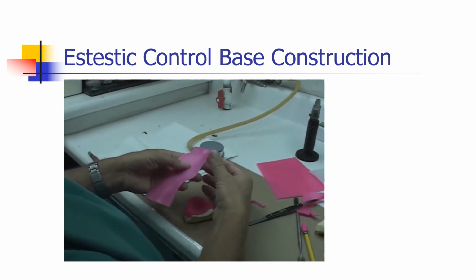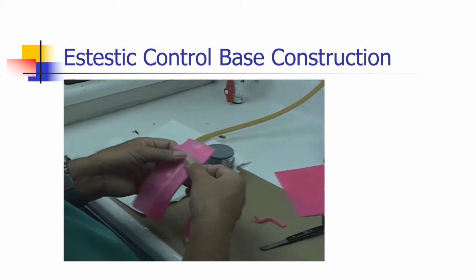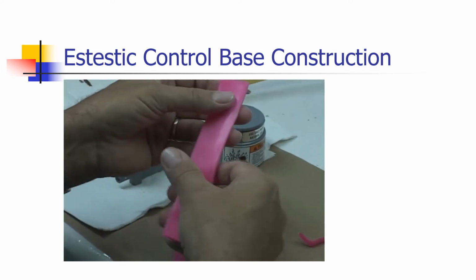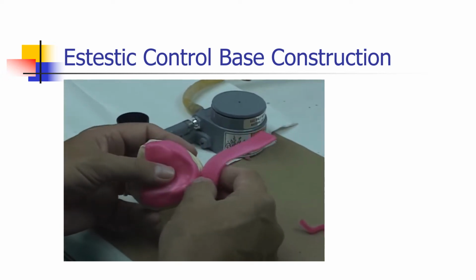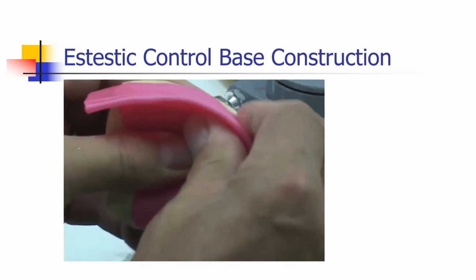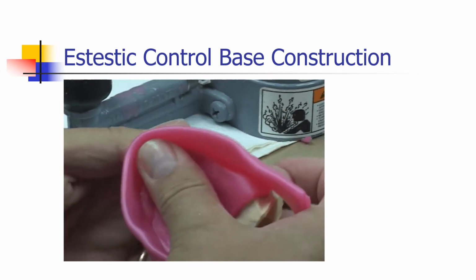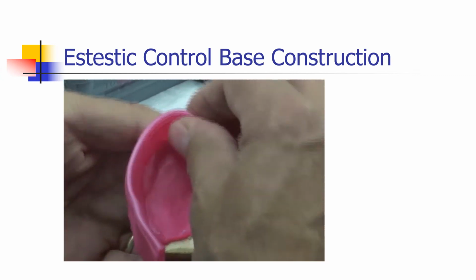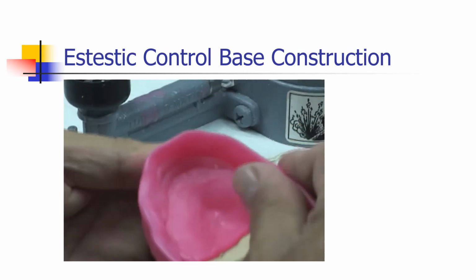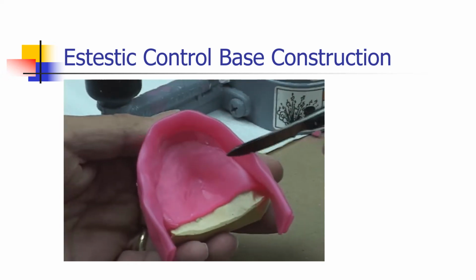Okay, now we've got it warmed up. See how nice and pliable it is. We're just going to fold it over in thirds. It takes two sheets of wax to make an esthetic control base for the maxilla. Then we just place it into the mucobuccal fold and start molding the wax in and shaping it. And then we're going to cut the tail, the back end, off with the waxing knife.